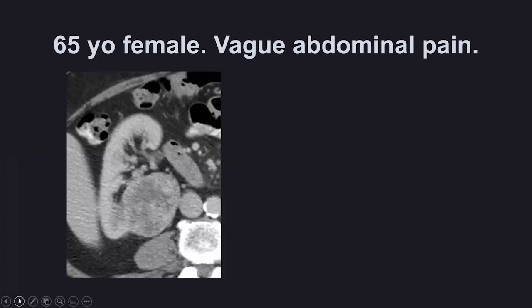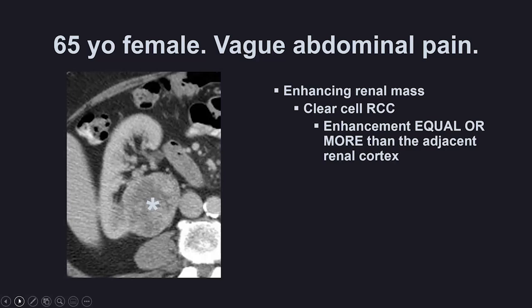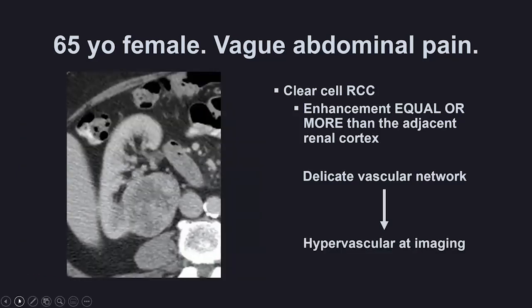Case two: we have a 65-year-old female with vague abdominal pain. We have an enhancing renal mass. The diagnosis here is clear cell renal cell carcinoma. The enhancement is equal or more than the adjacent renal cortex. That's because clear cell renal cell carcinoma under the microscope has a delicate vascular network with a lot of blood vessels — a lot of vascularity for a low-power image. A delicate vascular network under the microscope translates to hypervascularity at imaging. So when you see an enhancing renal mass and enhancement is equal or more than the adjacent renal cortex, think clear cell RCC.